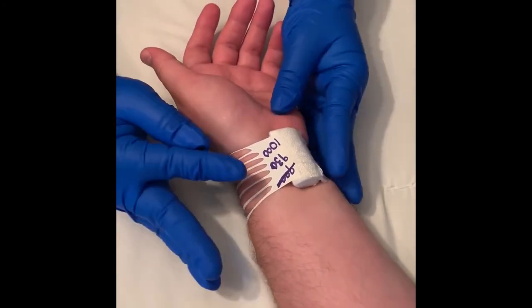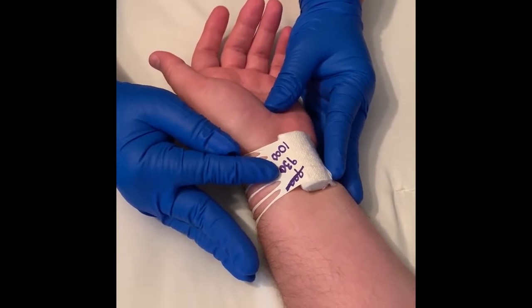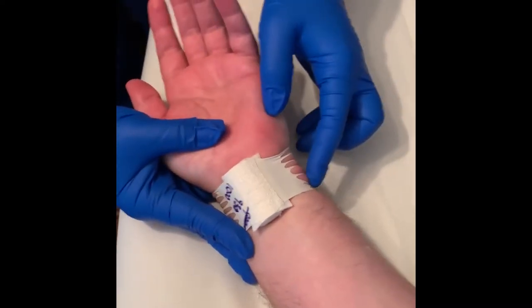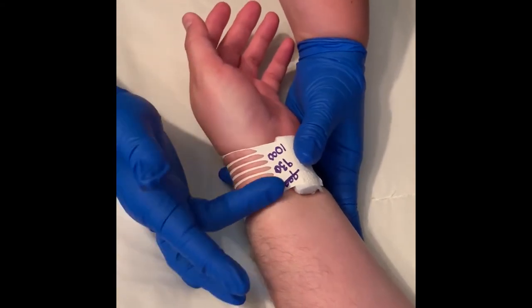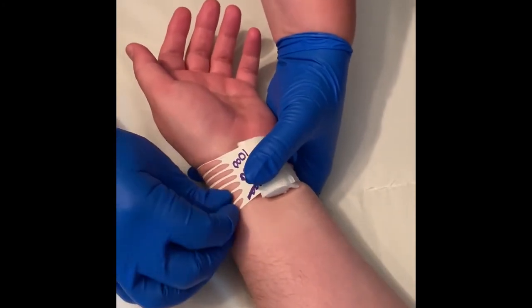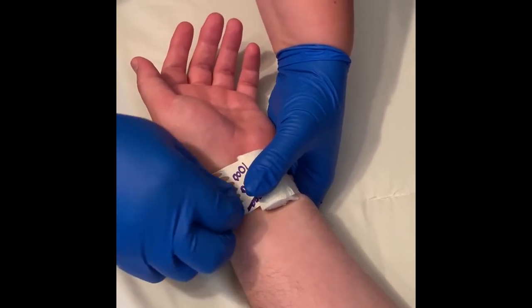In the recovery area, at the 30-minute mark designated on the band — time number two — alternating bands can be released on both sides of the dressing, allowing for a gradual release of compression. In doing this, ensure the outer bands remain intact and begin with the inner bands. Ensure you hold the roll in place while breaking the bands so as not to disrupt the clot.